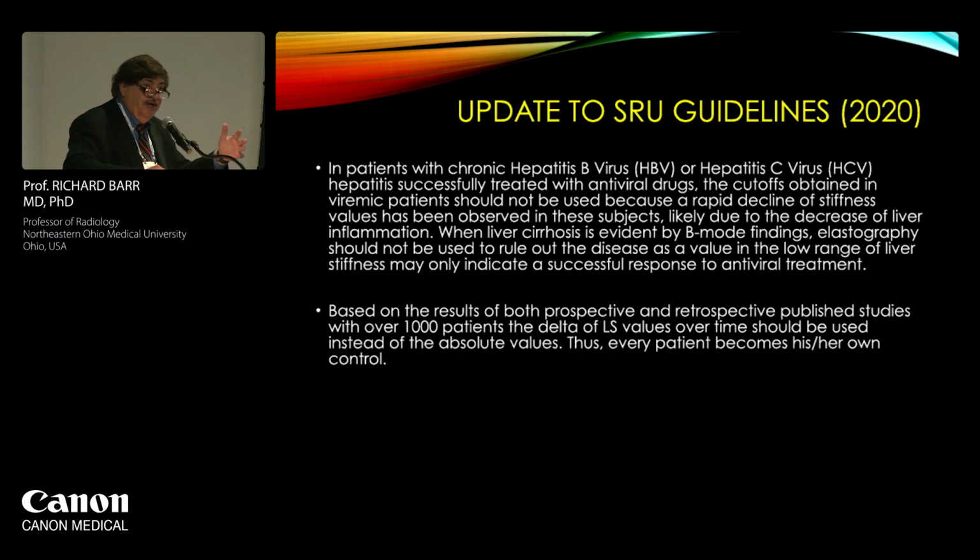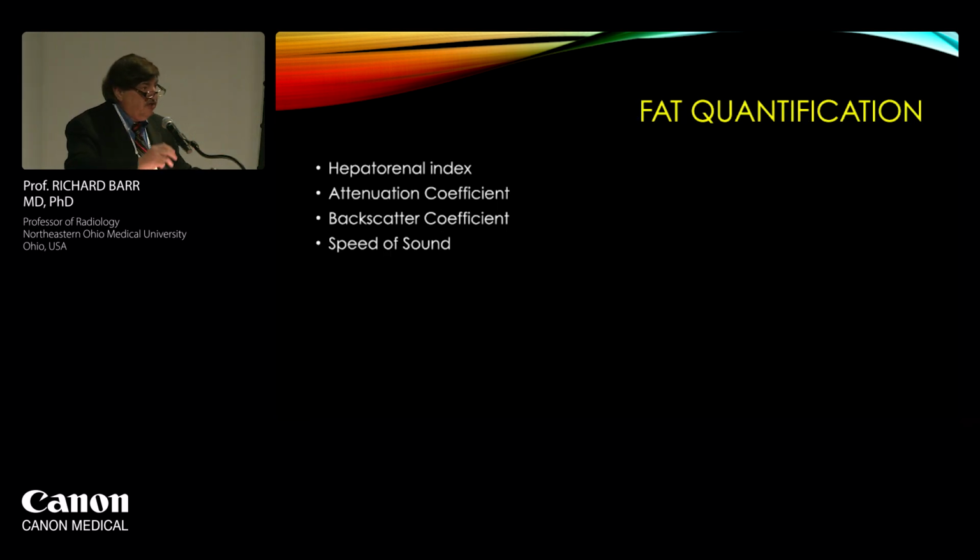So theoretically, we could go do liver stiffness values every day in the cardiac intensive care unit, and you can tell if the treatment is working because fibrosis is not going to change daily, but the treatment of their congestive heart failure will. Again, Dr. Ferrioli is going to kind of go over fat quantification, but I just want to bring up that we have the hepatorenal index.